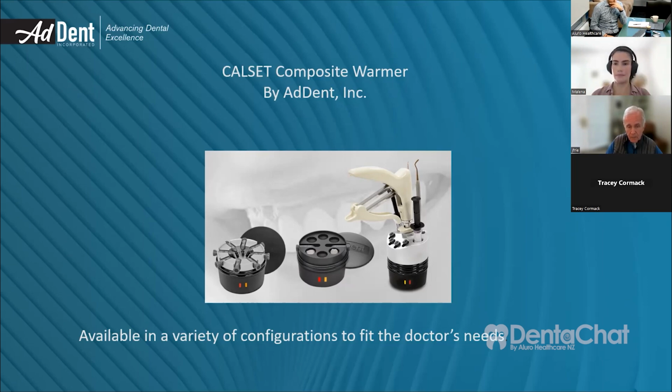Okay. Just going back to the temperature. So we advise to get into the green, which is the body temperature. From there, you do a couple of clicks to the red to get your composite there. How long will it take between the green and the red, and also for the compules to get there? That's a good question. It's very short. It might take 30 seconds or something like that. Okay, 40 seconds. I'm not sure, but it's not long at all.